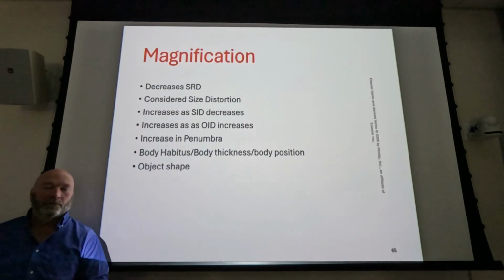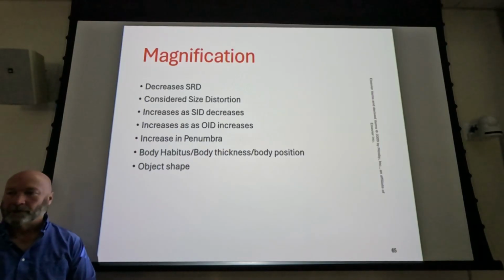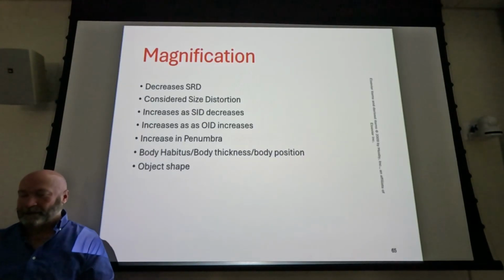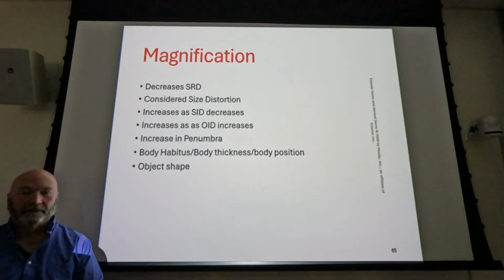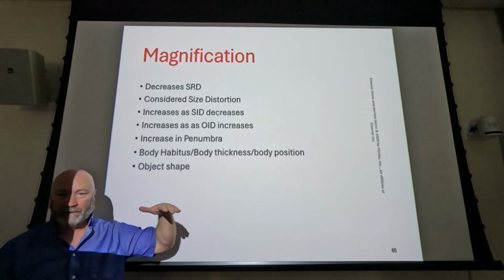Okay, so now the patient doesn't weigh, but the patient measures 35 centimeters. Where would you put it now? Or let's even make it extreme. They measure 49 centimeters. Where would you put it now? I'm confusing my numbers. Let's say the patient measures 33 centimeters. Make it easy. Where? 11. Right. So forget all the other numbers. It's 1/3 of the way through. So if we have a hypersthenic patient, then it's naturally going to increase OID.